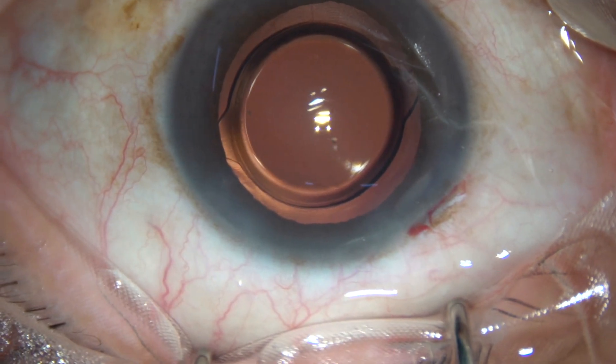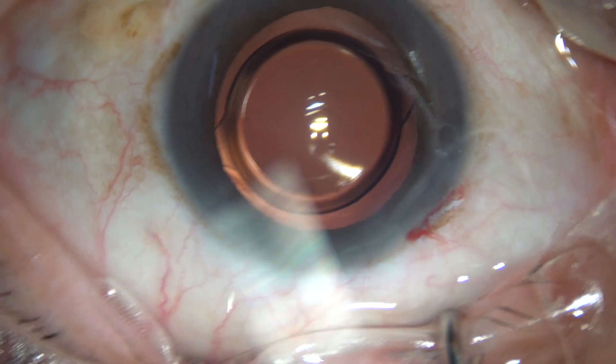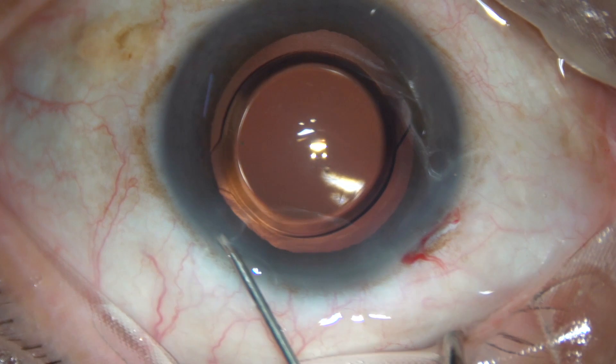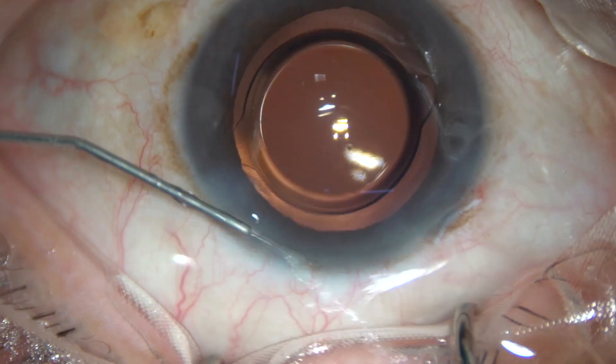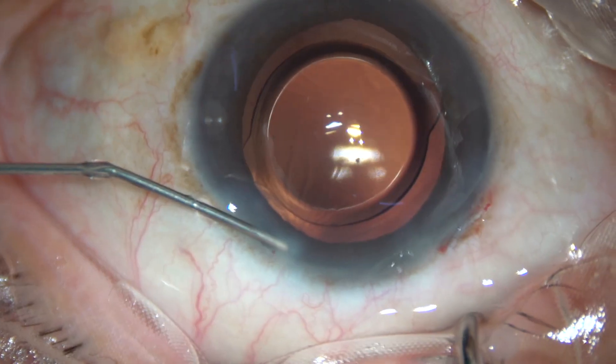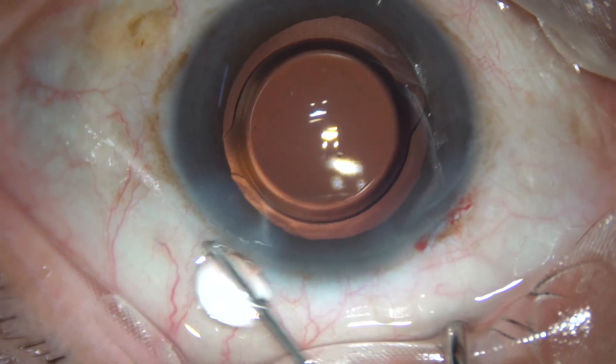This is a bit of moxifloxacin. And now the single side port is hydrated like this, and this step incision becomes waterproof.